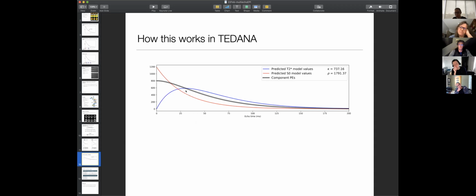Right, Suzanne, just correct me if I'm wrong. The ICA works on the time series of different echo times of a single voxel. Is that right? So the time series, yeah. Because you have multiple echo times, now you can estimate that decay curve. Yeah, you have the multiple echo times, and then you have it for each TR, and you do an ICA on that. With the idea that whatever changes the intercept of that decay, namely the S0, is going to be independent of the thing that changes the T2 star. Yeah. Okay. That is the underlying idea.